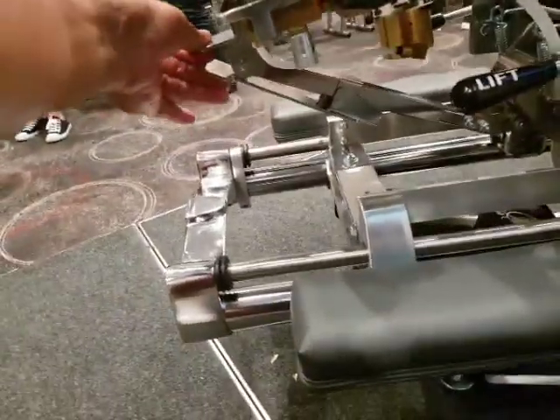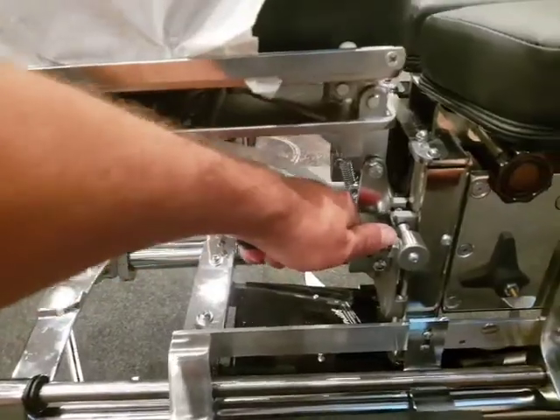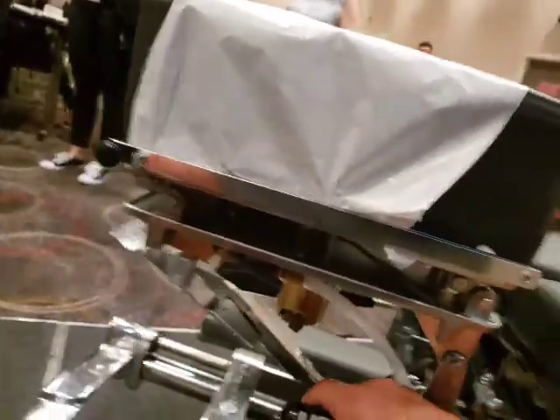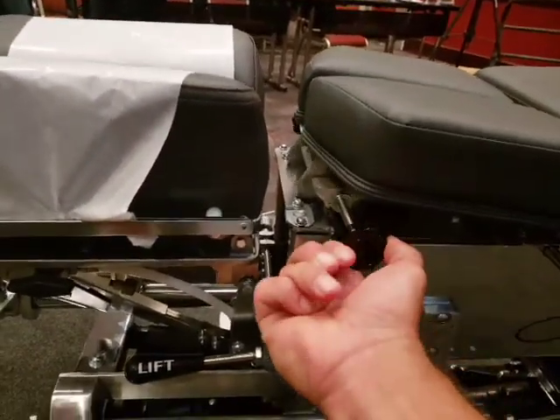To tilt the headpiece, push this and it should move with fingertip pressure. To raise and lower the headpiece, just lift this gently — it doesn't need much energy. To push it down, hold there and push down onto the cushion itself. You can also change the angle of the dorsal section just like this.